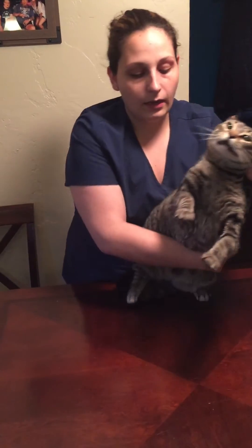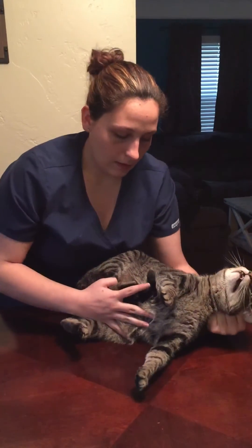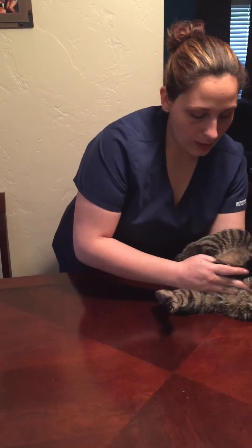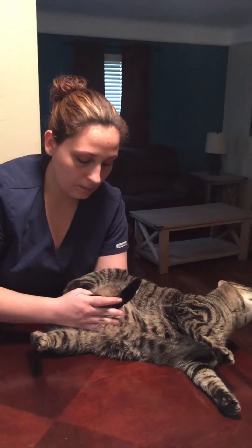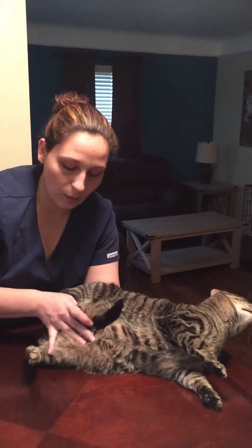You want to lay the cat in lateral recumbency, and you always want to make sure that the cat's back is aligned with your arm so that the cat doesn't have access to the other person who's actually drawing the blood. Make sure that you tuck the tail and the leg that's more towards you by the belly, so that the person drawing the blood can pull the other leg out and have access to the saphenous.